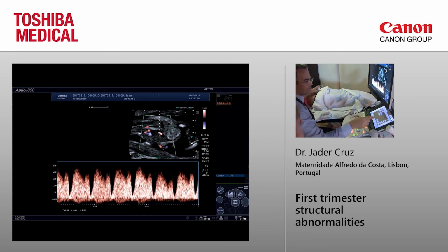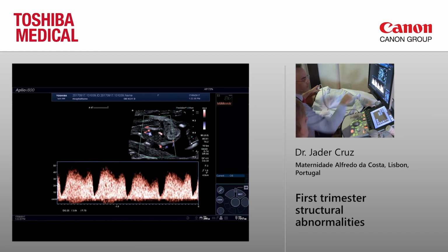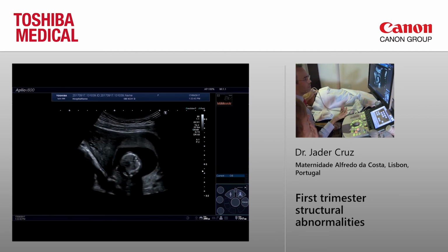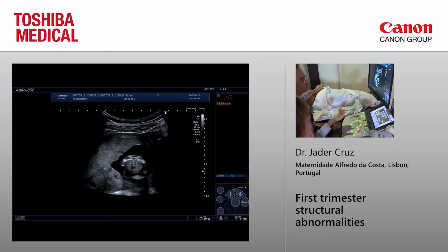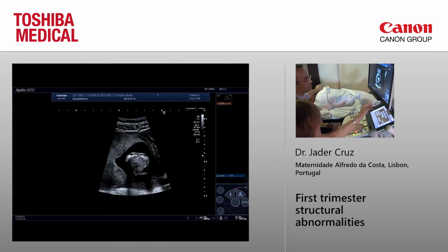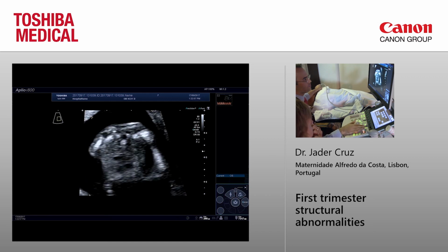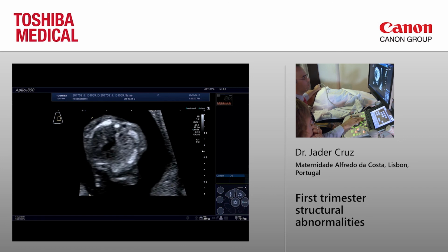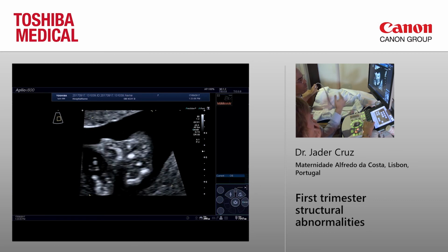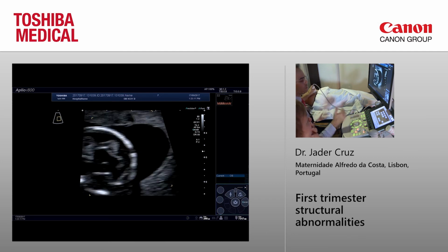How do you increase the sweep speed? Oh, the sweep speed. Yeah, you should have a higher sweep speed to see better the A wave, and then you measure. Nowadays for trisomies, you measure that. Tricuspid, I hope I can show you the heart there. Yeah, you can also do as you do with the ductus venosus, either from the front, from apical view, or from the back. You need the baby to be still to measure that. Not the case.